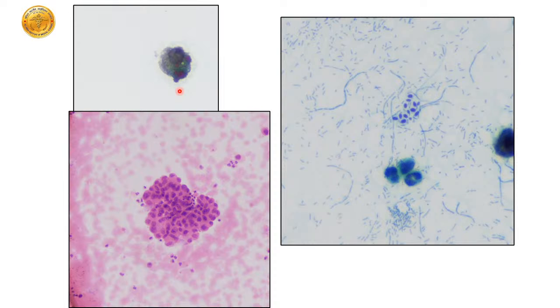And just some elongated bacterial strands. These are yeast forms or spore forms of Candida, with neutrophilic infiltration. What do we call these? We say these are NHGUC, that is, negative for high-grade urothelial cancer.